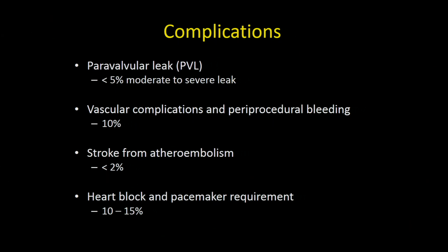Let's talk a little bit about complications. Happily, these don't happen as often as they did when the procedure was sort of in its infancy. But here are some of the key complications that we are meticulous in trying to avoid. So number one is paravalvular leak.